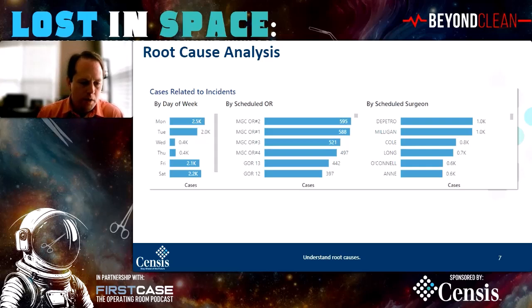So you've got a scrub tech that starts the procedure, and then somebody comes in to give them their lunch, and that person finishes the procedure. Well, the person finishing the procedure walks in, instruments are already out, right? On the back table, they're on the Mayo stand. And they don't necessarily know where those instruments go. So it's much more likely at that time that they're going to put them back in the wrong tray.